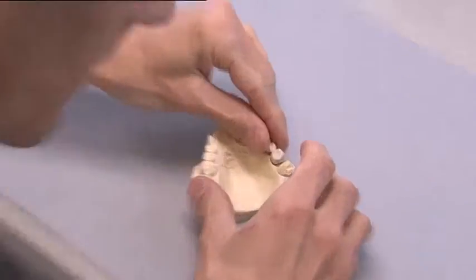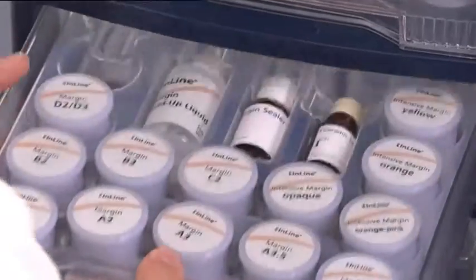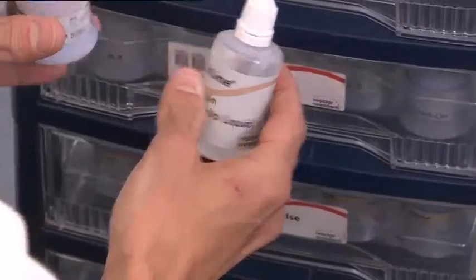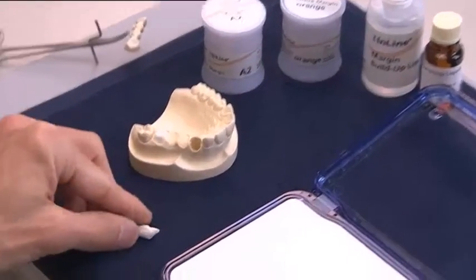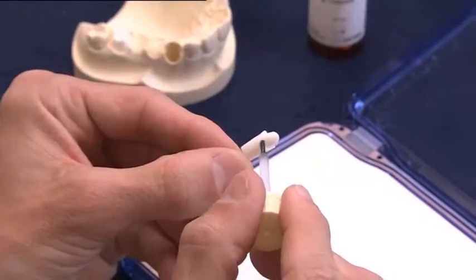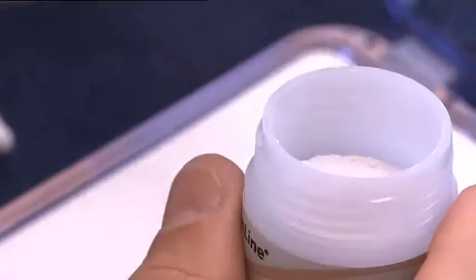Place the opaquerized metal framework on the model. Choose the respective margin material and margin buildup liquid from the modular and clearly arranged kit. First, the model die is isolated in the cervical area with IPS margin sealer. Once the sealer has dried, IPS ceramic separating liquid is applied.